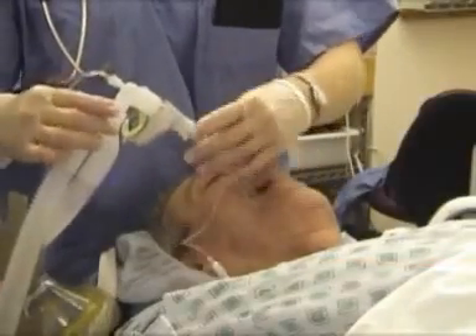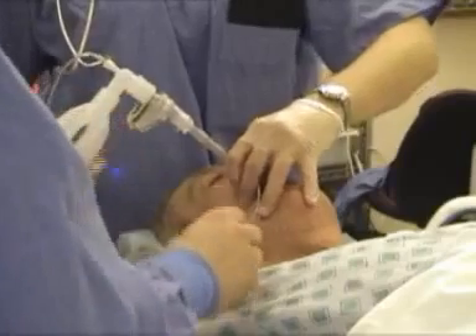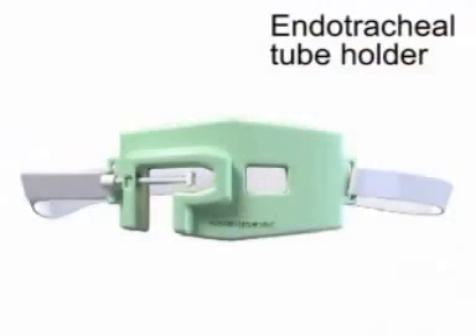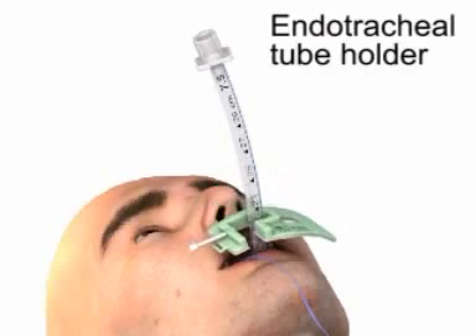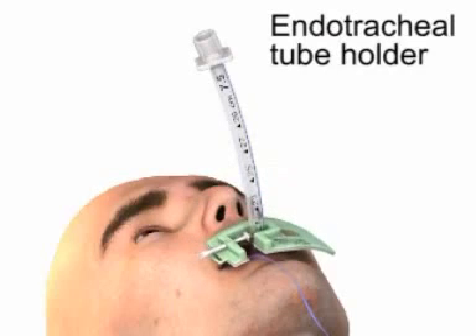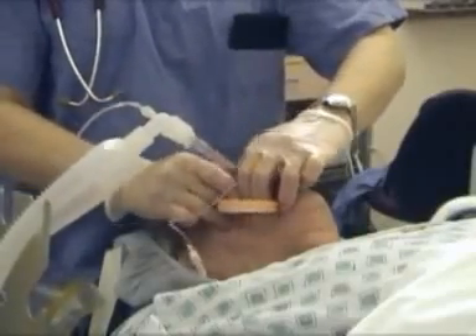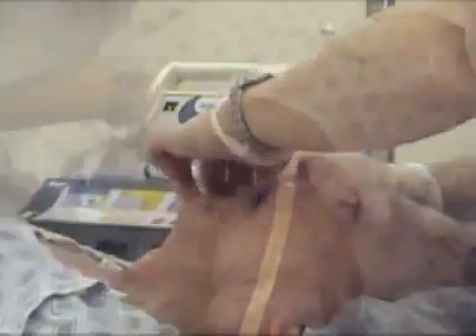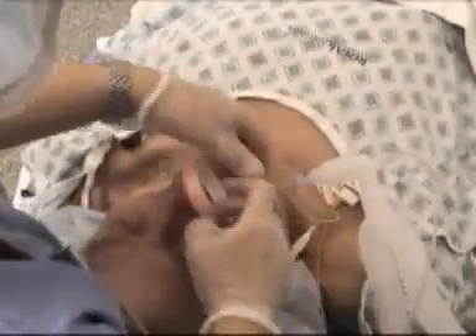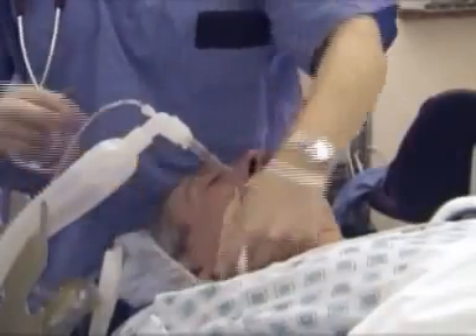Secure the endotracheal tube to the patient's head once proper position has been confirmed. If available, you should use an endotracheal tube holder to secure the tube, as these devices aid in the prevention of accidental displacement. If such a device is not available, tape may be used instead. First, attach the tape to the patient's cheek and then wrap it circumferentially around the tube. Next, affix the free end of the tape to the patient's other cheek.